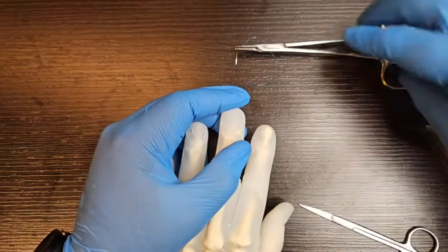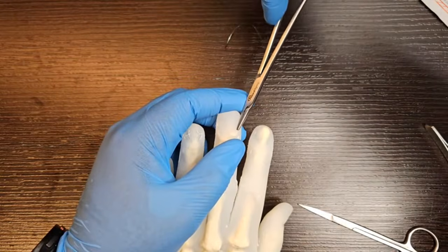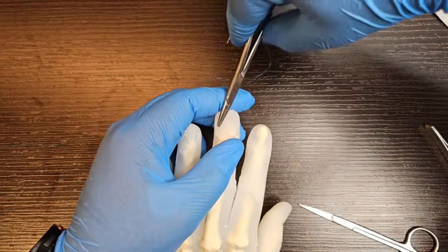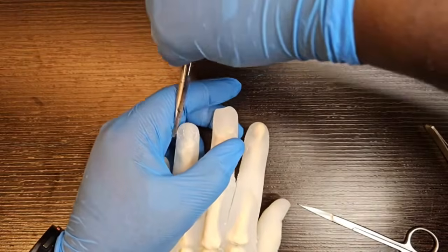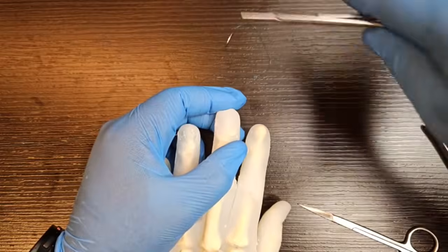You then get an artery clip or a needle holder. You start on one side, clip it, and then roll the needle holder away. And it just comes off nicely. When you get to one edge, then you have to peel up. All right.